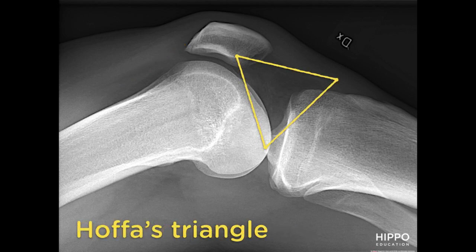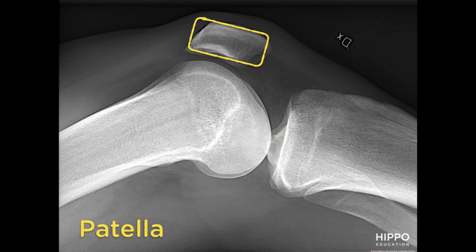Third, Hoffa's triangle — the area around the anterior femoral condyles — in a normal knee is radiolucent, or dark. Finally, in a normal knee x-ray, the patella is not anteriorly displaced.